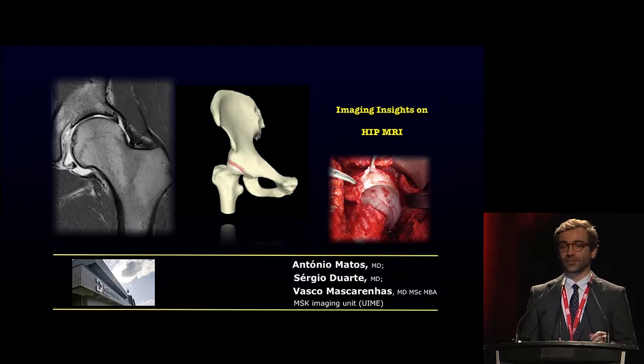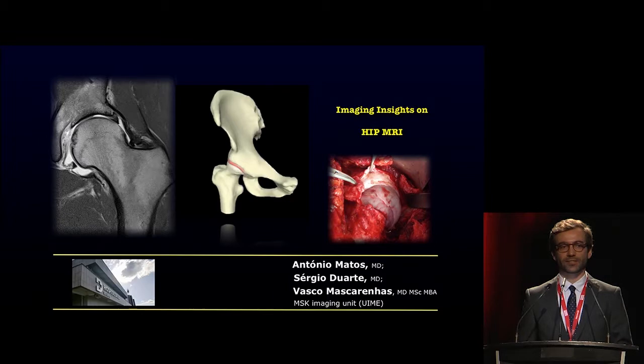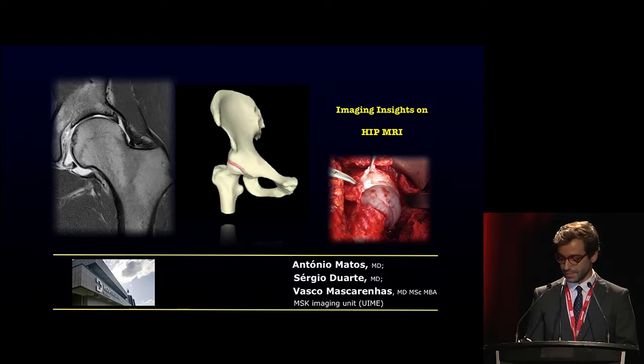I was invited to talk about the application of MRI in MSK radiology, the clinical application, and I chose to speak about hip MRI because it's quite a hot topic with some controversy behind it, and I hope to talk about this for a few minutes.